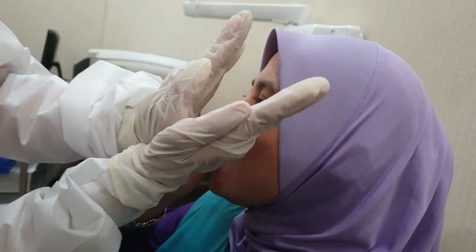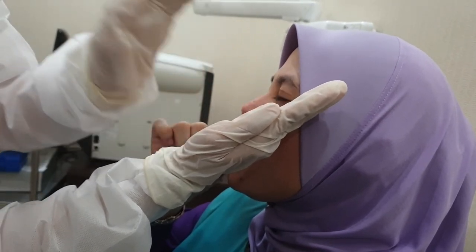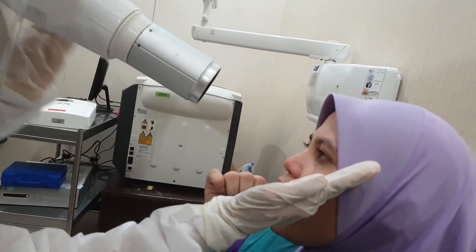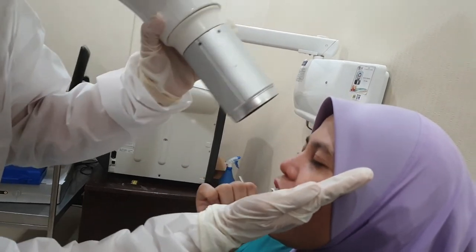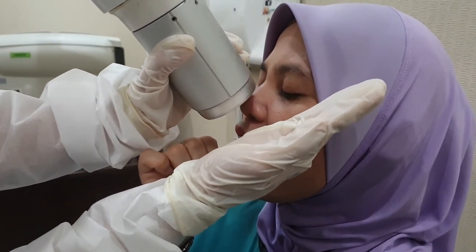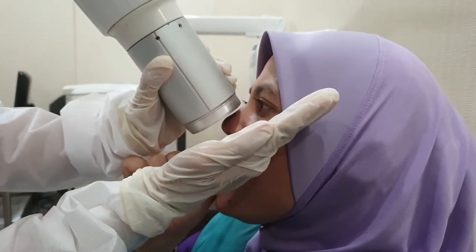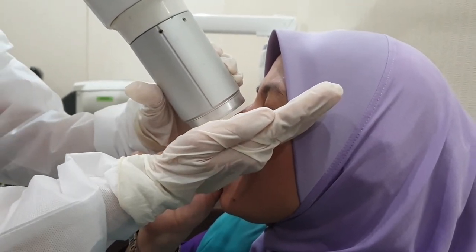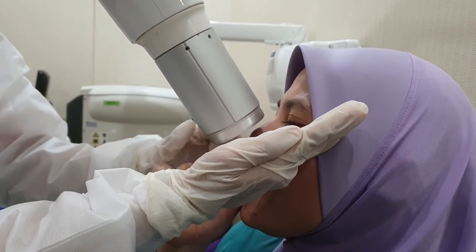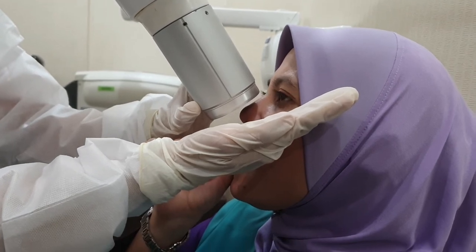So I would imagine there is one imaginary line in between these two lines, and the line would be here — stick to this line. Get your X-ray tube and adjust it 90 degrees to your imaginary line. And make sure your tube is placed at the center part of the film so you won't have a cone cutting effect. If you're happy, then you can press the button.